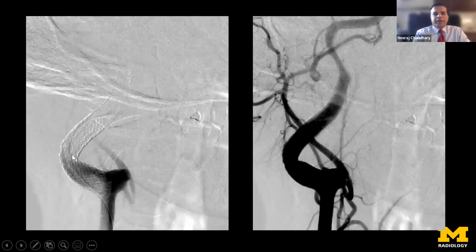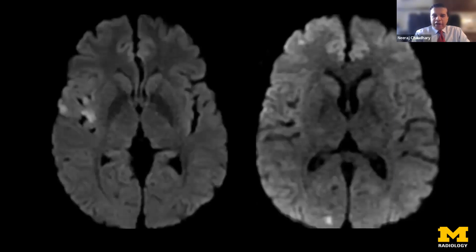We basically ballooned, dilated the stent a little bit to apply it to the vessel wall a little better. And here you see restored flow. And the patient did improve gradually over a period of a few months, was back doing what he loved to do in life, that is his profession, and is back working at our institution.